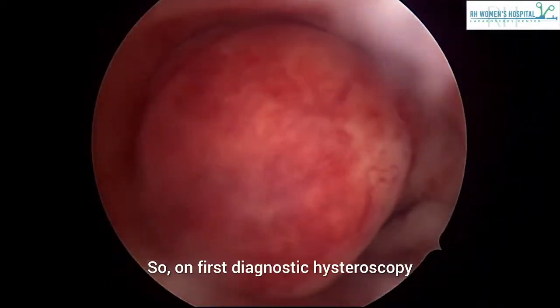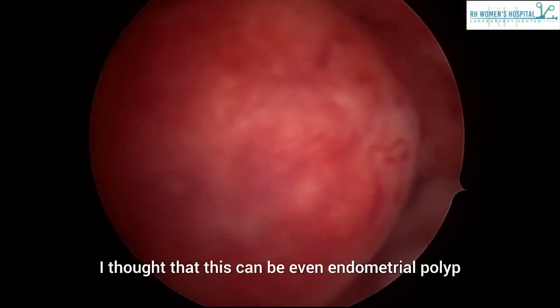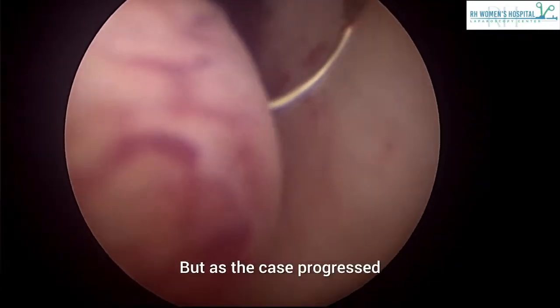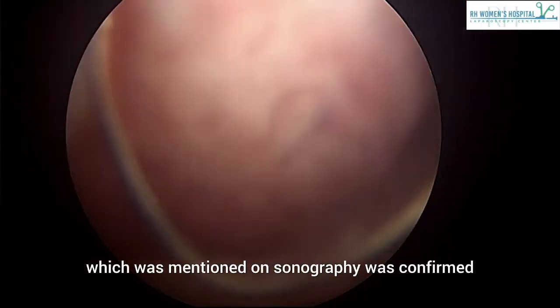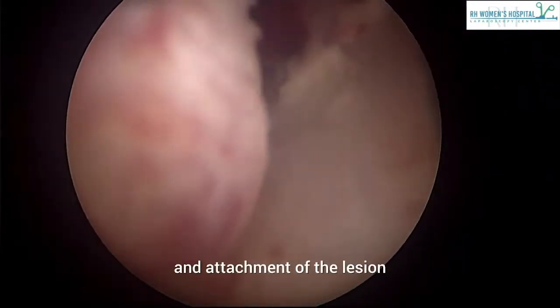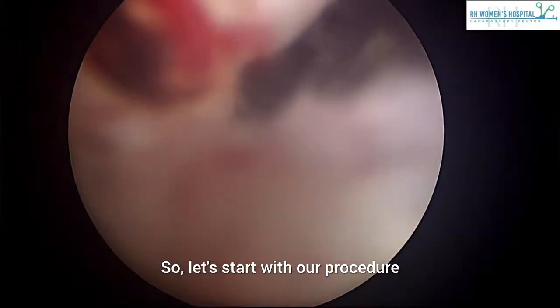So on first diagnostic hysteroscopy, I thought that this can be even an endometrial polyp, but as the case progressed, the diagnosis of fibroid, which was mentioned on sonography, was confirmed looking at the consistency and attachment of the lesion. So let's start with our procedure.